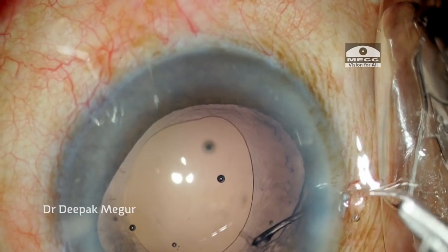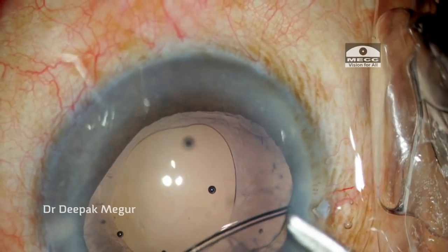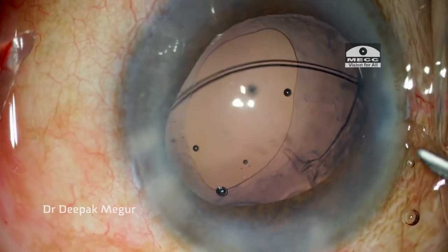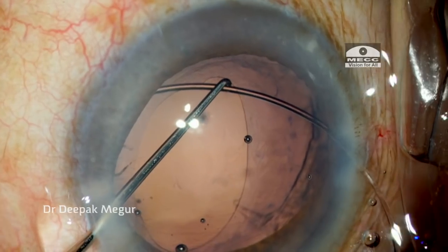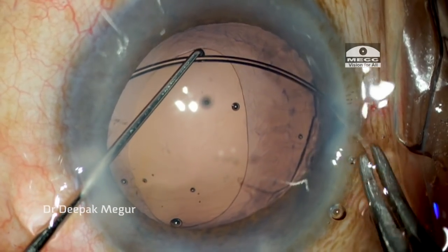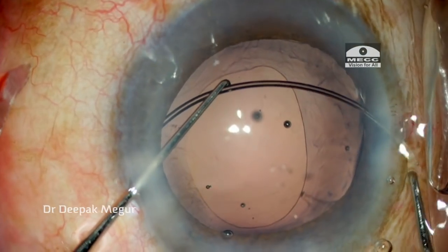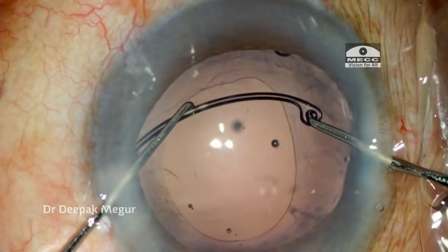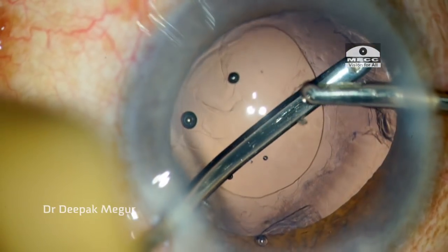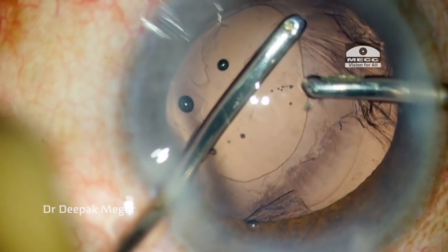Through the side port the CTR is threaded; it goes under the anterior capsule and about half of the CTR goes into the bag. Then using the second instrument, I compress the ring so that it doesn't put any stress, and the remaining CTR is gently dialed into the bag ensuring that the area of zonular dehiscence is adequately supported, and the remaining cortex is patiently removed.